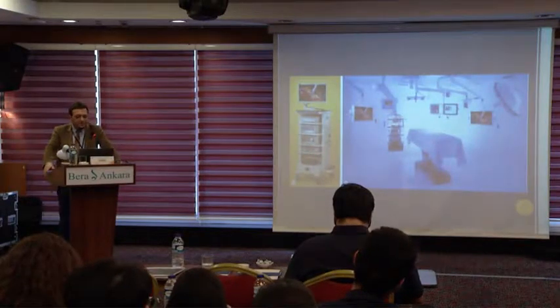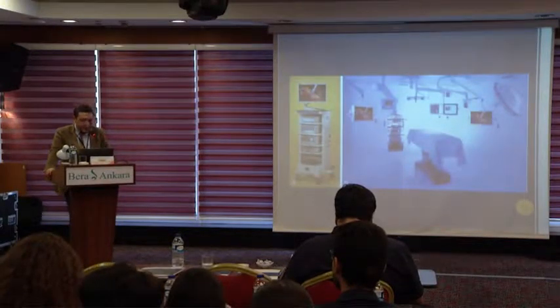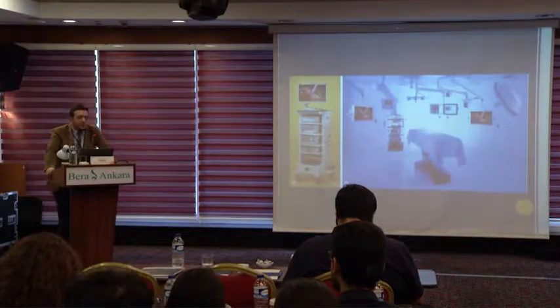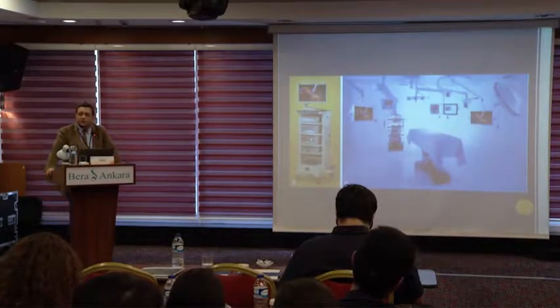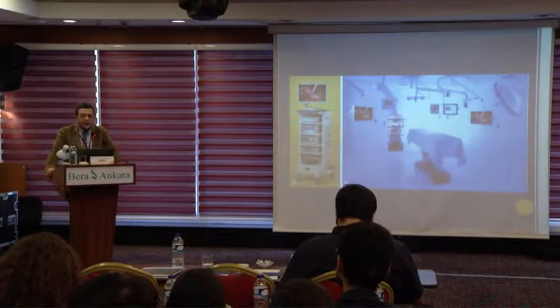The main topic for laparoscopic surgery is to know anatomy very well and to have all the vision of the operative field. Probably the most important tool for laparoscopic surgery is the system for vision. It's possible to perform a procedure with a tower which includes a camera control system, light source, insufflator, and maybe a recording device.